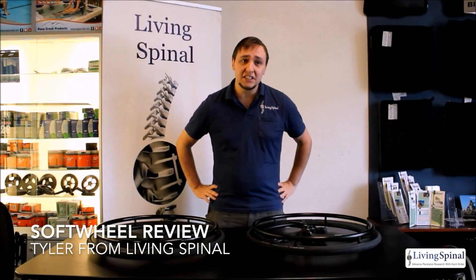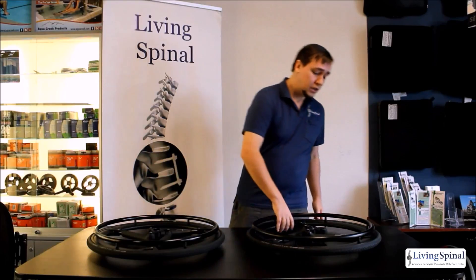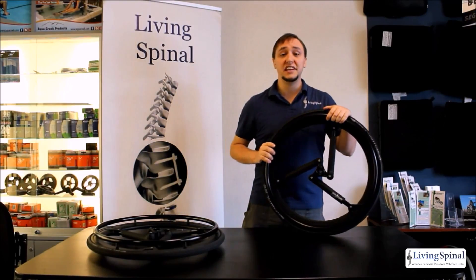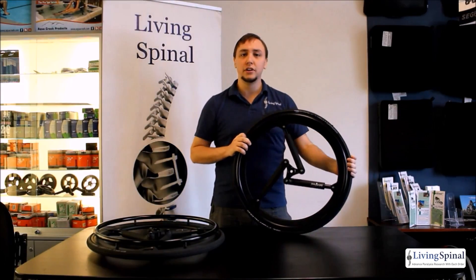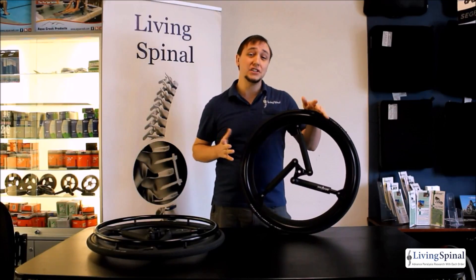Hey everyone! Tyler here with Living Spinal, and today I will be presenting you with the Soft Wheels. The Soft Wheel is a lightweight wheel designed and built with the needs of active users in mind. The Acrobat Soft Wheel provides freedom to the wheelchair rider by allowing a smooth and comfortable ride over varied terrain.